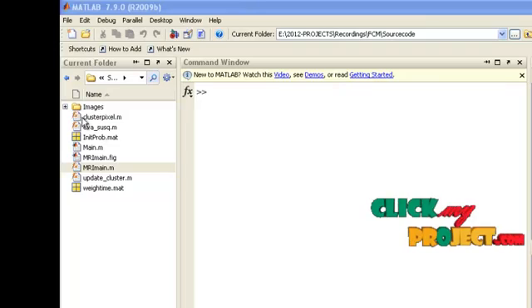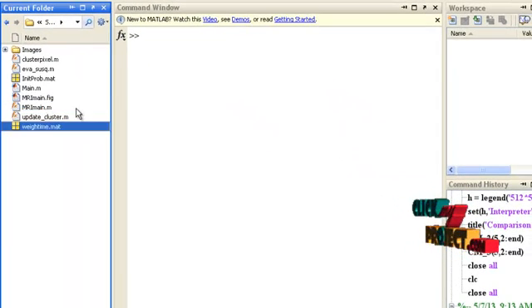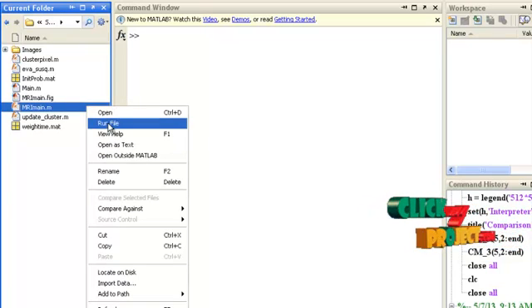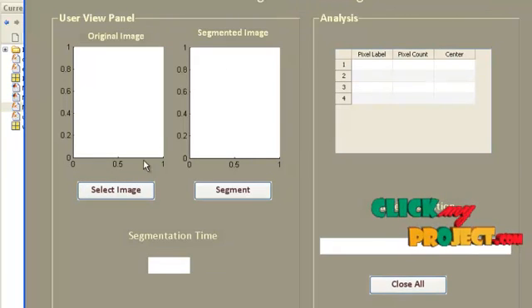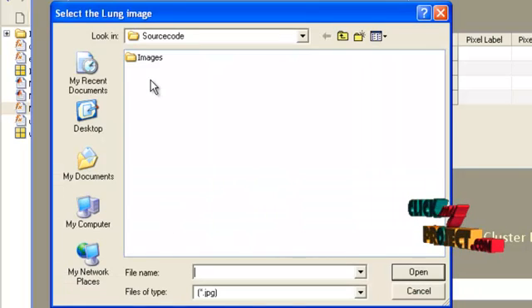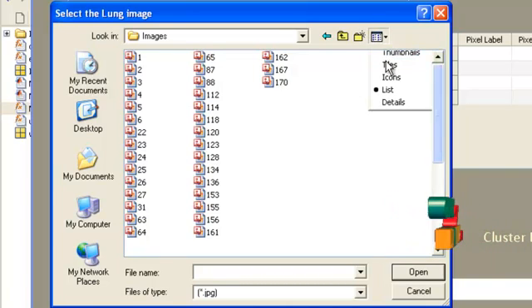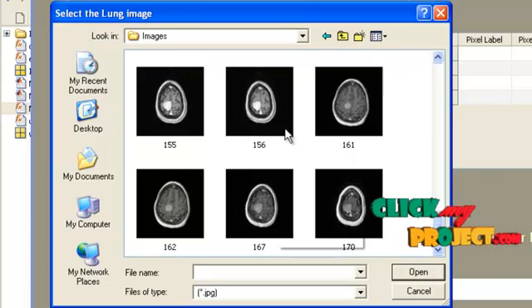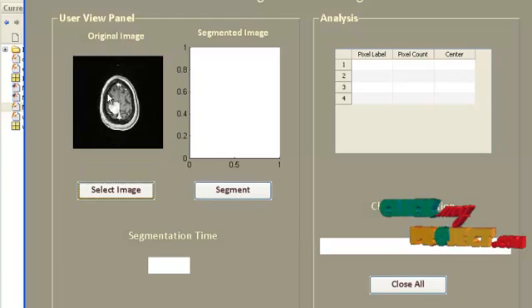Now let us see the execution of our proposed implementation. This is the main file, Main.m. Select the run file. The GUI window will be shown. Press the button 'Select Image', then under the images folder select any one. I am going to select this image.